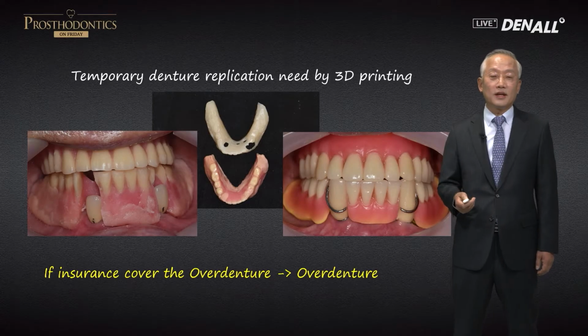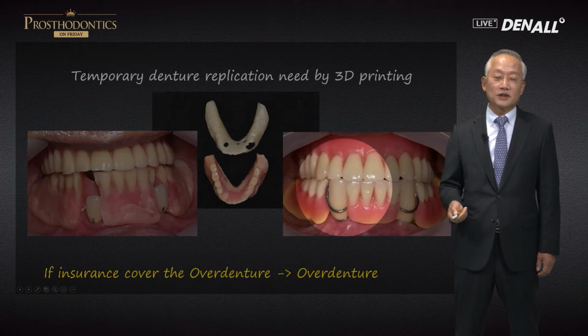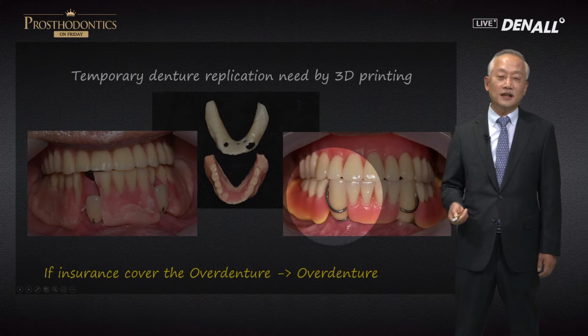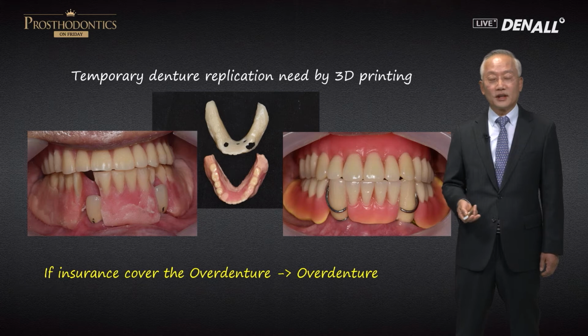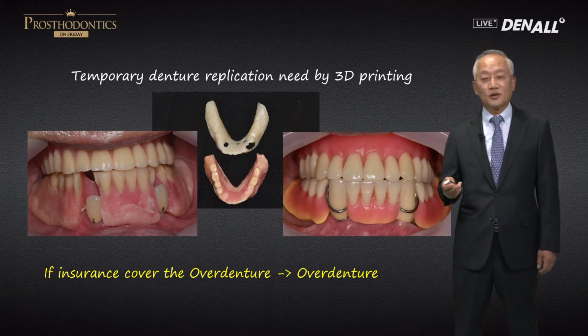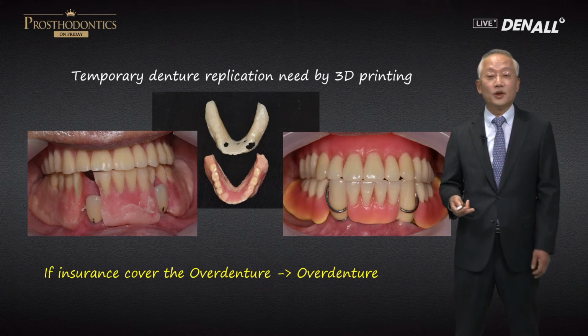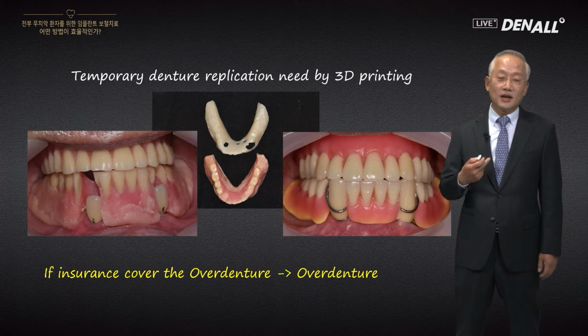One of the cautions we need to take is that accurate prosthesis with the correct size and shape fitting this denture needs to be created. It is more complicated than overdenture, and in aesthetic area, clasp can be noticeable, so it's not popular with a patient.